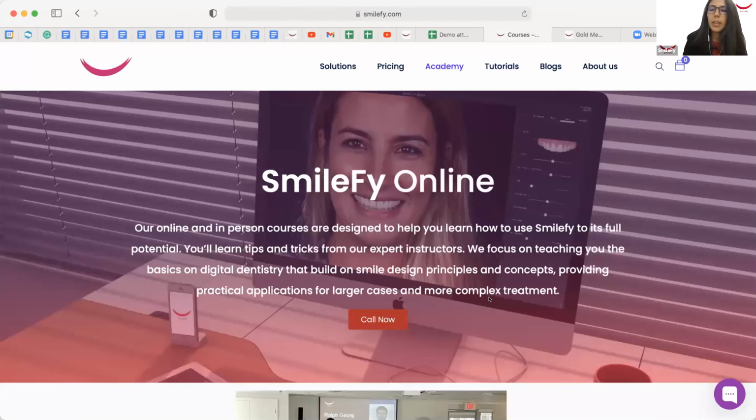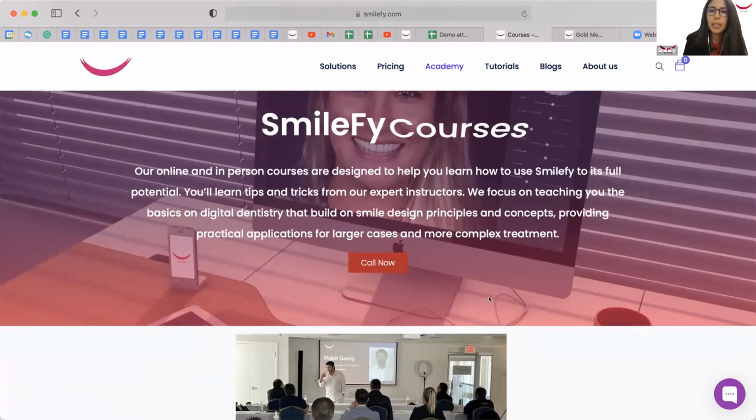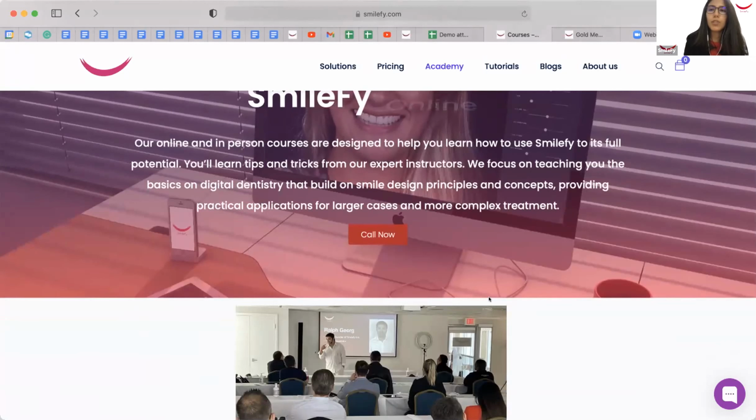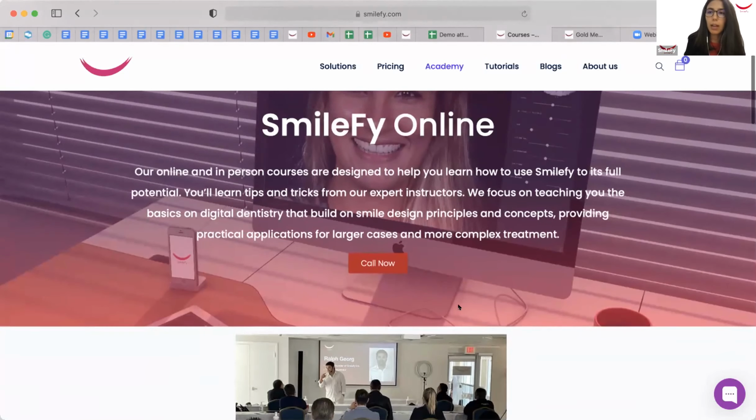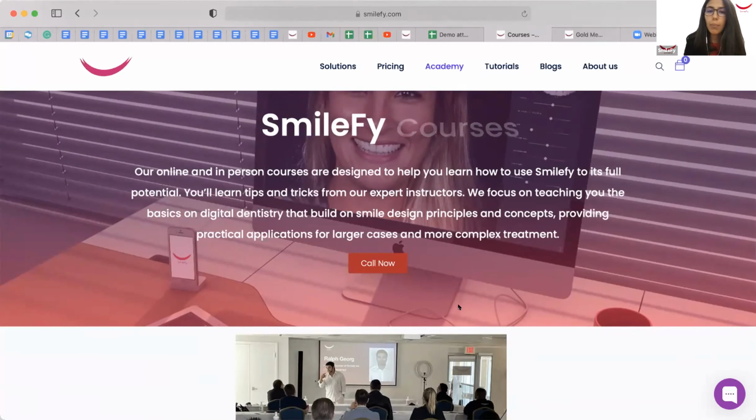Basically, what I wanted to show you today is what you can do next. If you are already a Gold member and you're using the SmileFy application already, then that's wonderful. But let's say you are at the beginning and you want to learn what Ralph showed us today, which is the 2D smile simulation with the 3D mockup. Now, we have our online and in-person courses that are designed to help you learn how to use the SmileFy app. And so you will basically understand how everything works and how the app works.